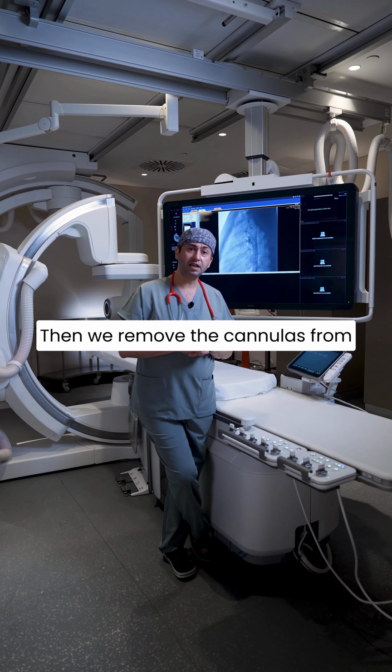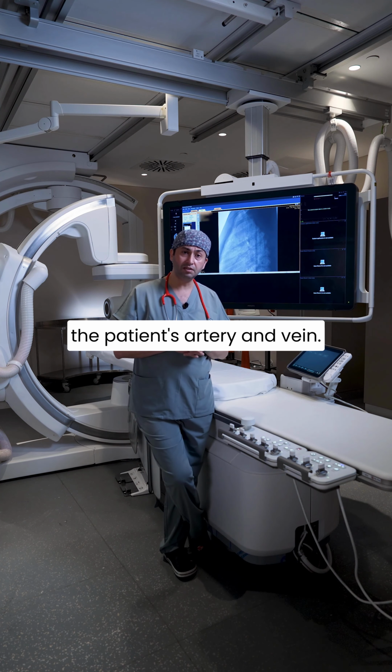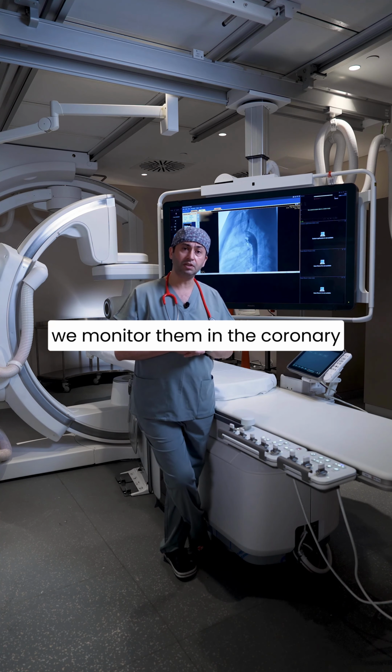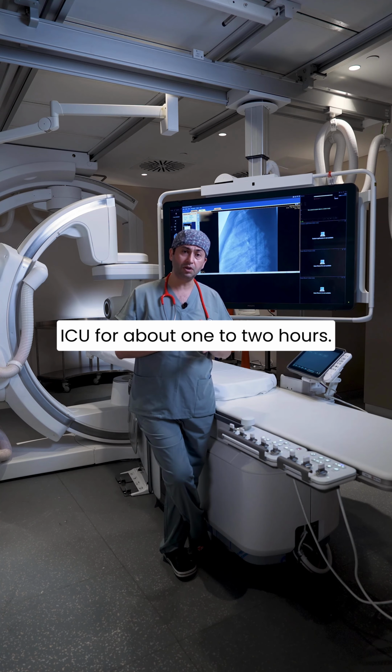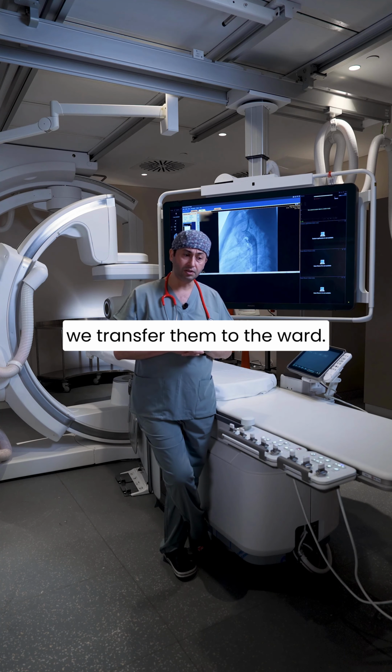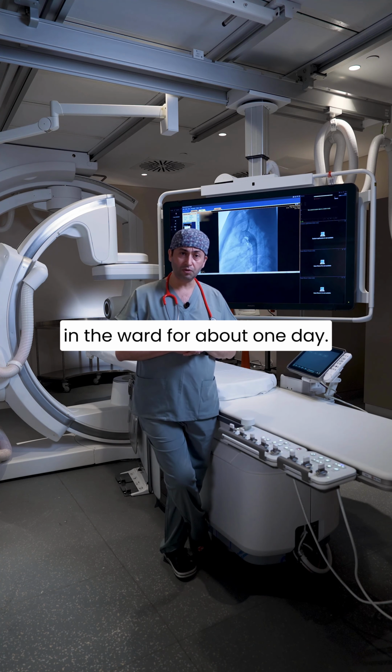Then we remove the cannulas from the patient's artery and vein. We then wake the patient up. To keep a close eye on them, we monitor them in the coronary ICU for about 1 to 2 hours. Once the patient is awake, we transfer them to the ward. We provide follow-up care in the ward for about 1 day.